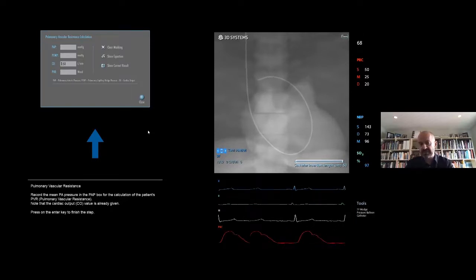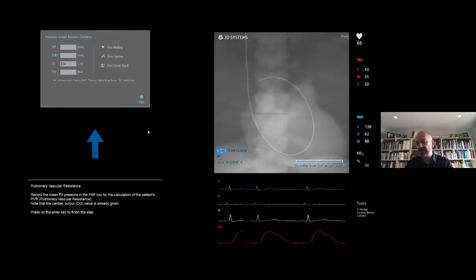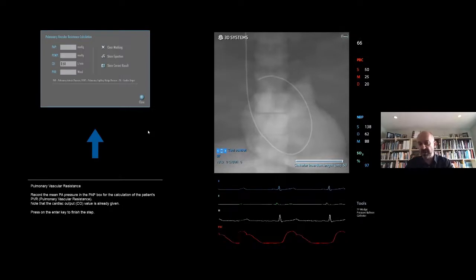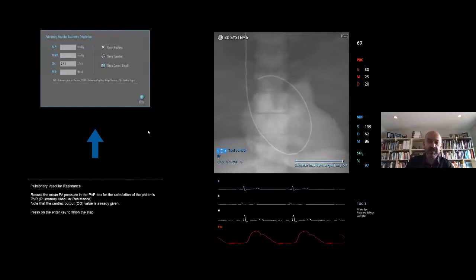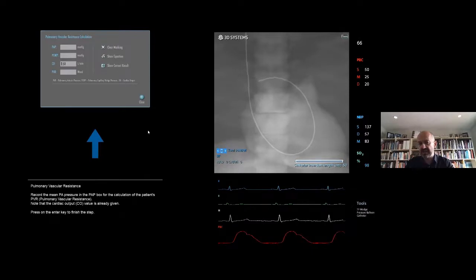This looks just like this. So you do that, and then the next thing is to measure thermal cardiac output. Take a look at your Swan and make sure you're hooked up with your thermistor to your computer monitor. Usually you need an assistant to do this because you're probably sterile at this point. Then you inject saline into the distal port, and you'll get a thermal cardiac output.